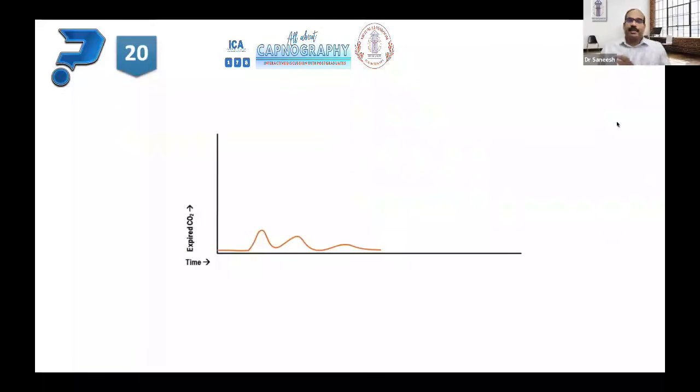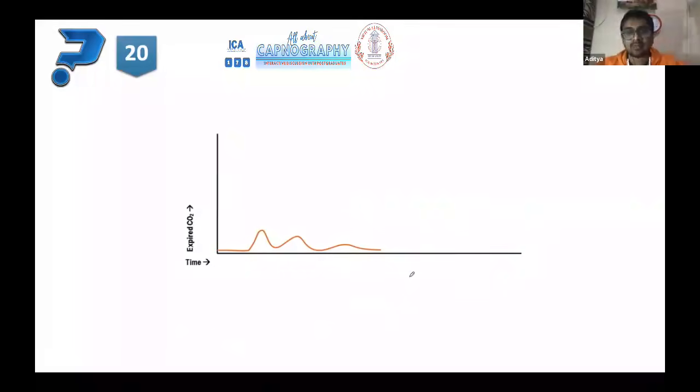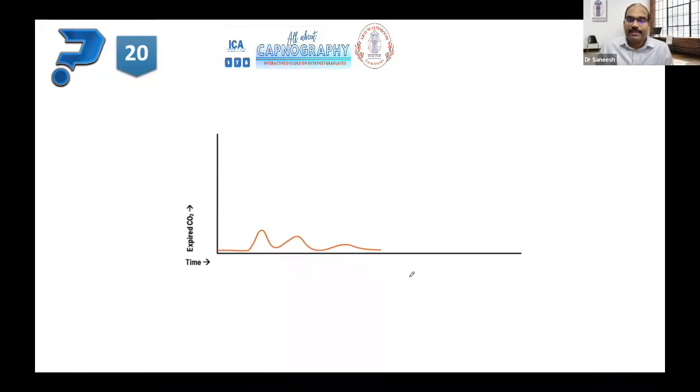Dr. Aditya, your friend has intubated a cardiac arrest patient, and this is what you find on the monitor. Depending on the value, it would show the adequacy of cardiac compressions. If compressions were ongoing, then I would try to target an EtCO2 of at least 10, but ideally 20 and above. Sorry, the patient is not in cardiac arrest. The patient is in distress. It's a trauma patient. Because the patient is in distress, the trauma team has decided on ventilation for primary survey and all.